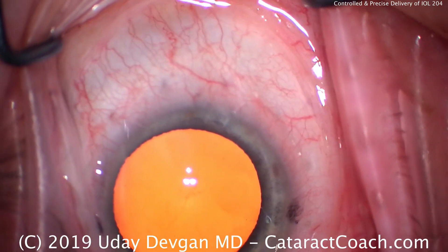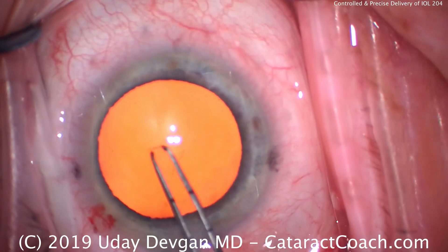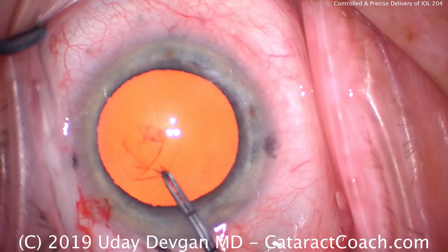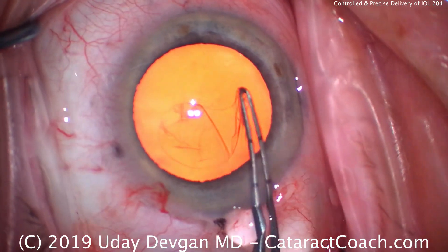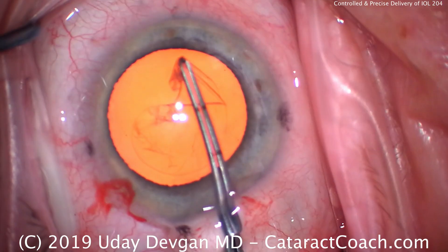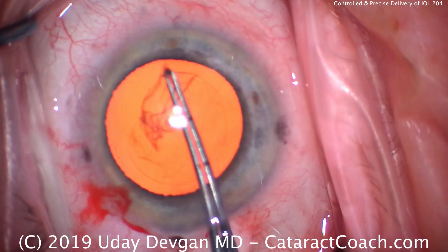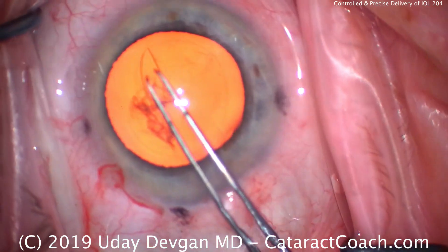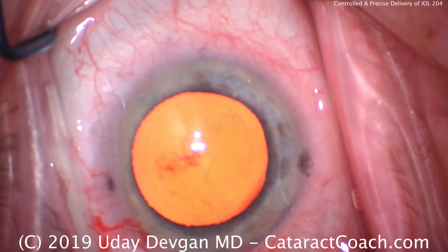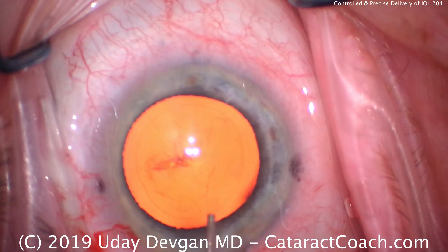The capsulorrhexis is next, but what I want to really focus on in this video is the IOL delivery. If we do this correctly and load the lens appropriately, we should be able to have a very slow, controlled, and precise delivery of the IOL into the capsular bag. This is the safest for the patient and easiest for the surgeon because it's very well controlled. This is how it's actually intended — companies have spent a lot of time perfecting their techniques and devices, and it's really important to follow their recommendations to get the optimal delivery of the IOL.